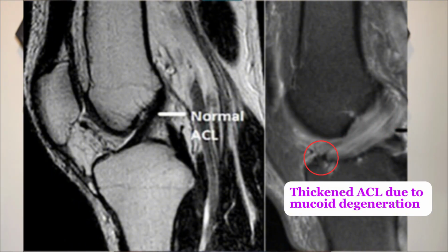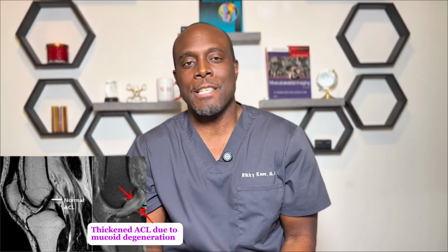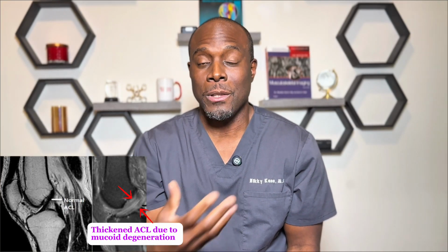It's not acutely torn. It's a gradual internal change from chronic stress. Many people with this finding have a stable knee and no functional limitations at all. Physical therapy is a very reasonable first step.